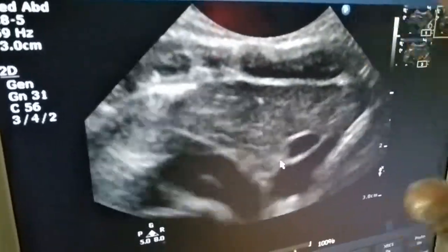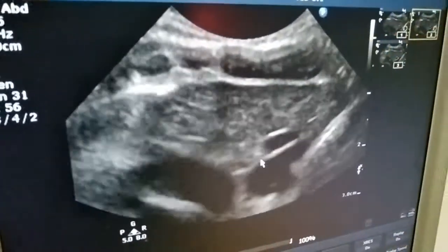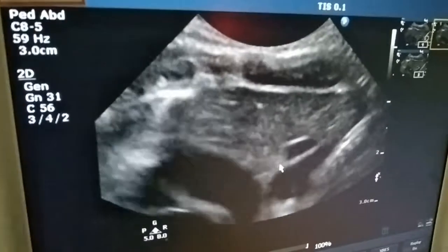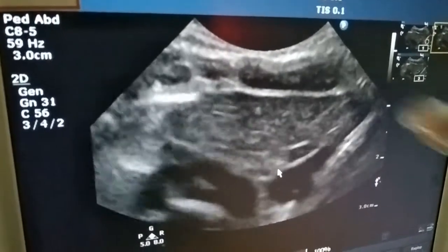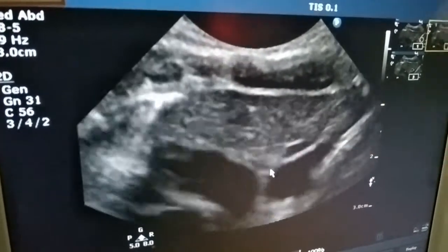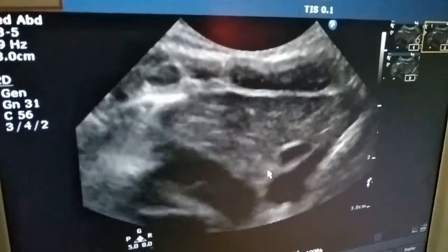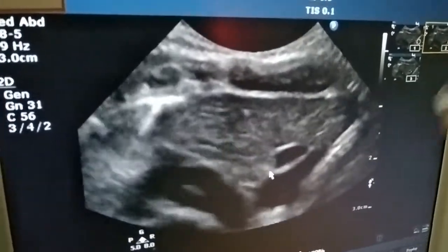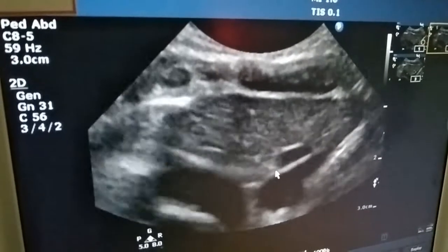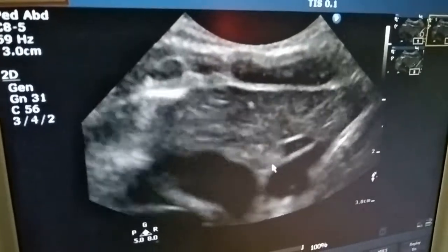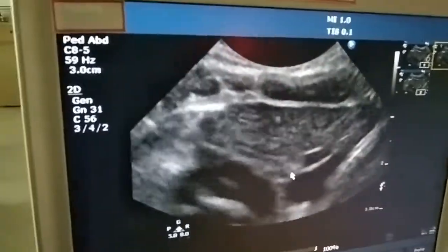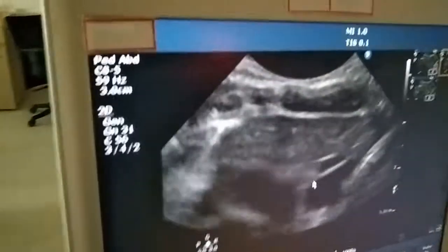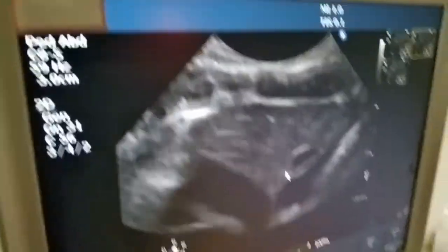The presence of thymus on ultrasound usually rules out DiGeorge syndrome. Here it is present and also it is not hypoplastic, so most probably this baby may not be a case of DiGeorge syndrome.